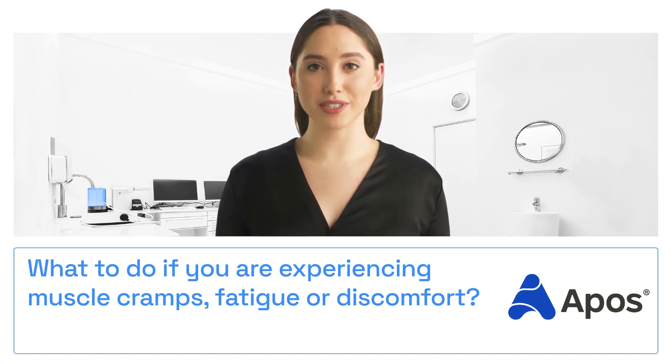You see, Apos helps your brain learn new ways to move. It's like teaching an old dog new tricks, but in this case, you're teaching your muscles to work better.